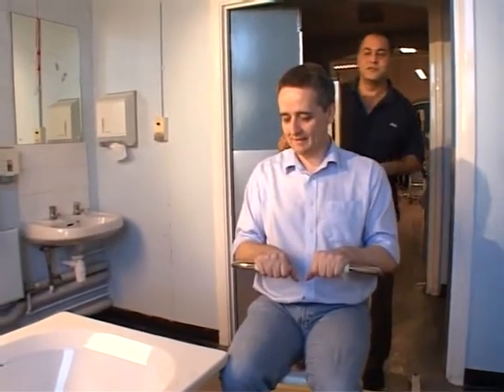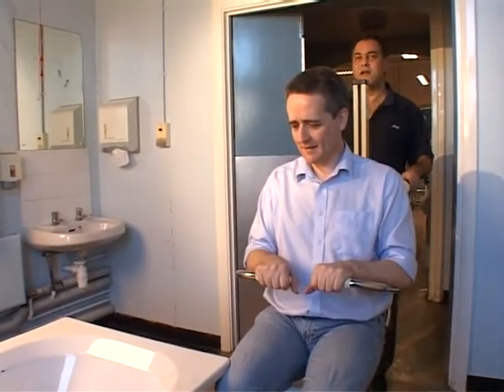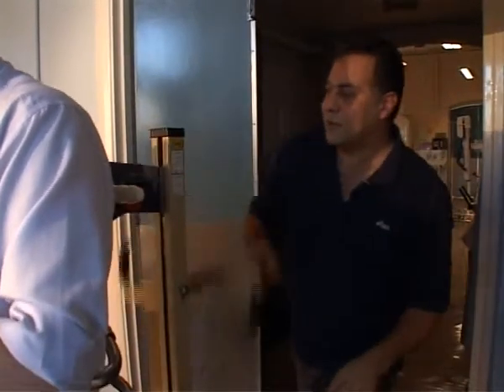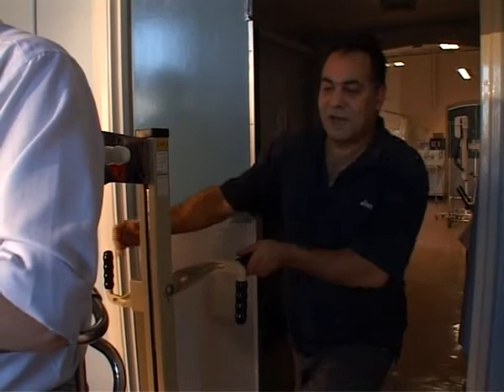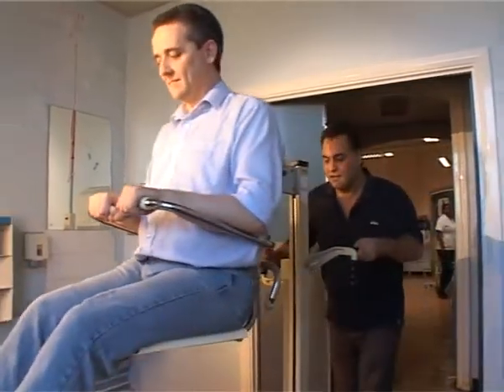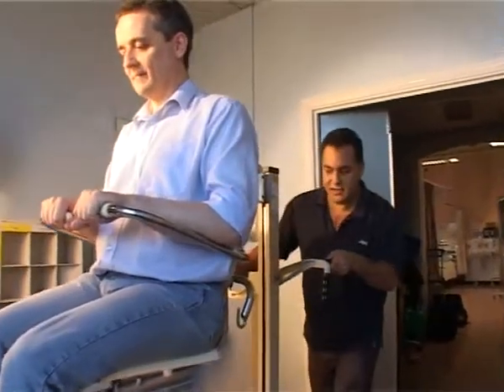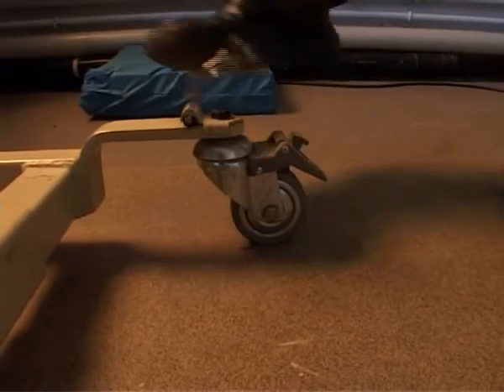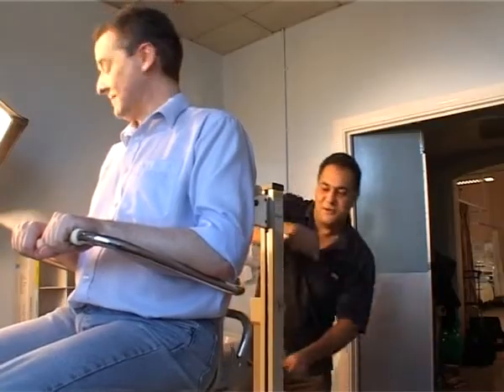This is a bath hoist used to put patients into the bath, and it runs on a ratchet and chain system combined with a runner. I will turn this wheel eight times, which in length terms would work out just over 12 metres, although the patient only moves around about half a metre. I shall now wheel you into the bath. Put the brakes on for health and safety, and lower you down.